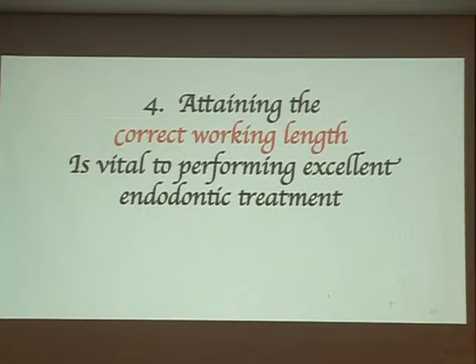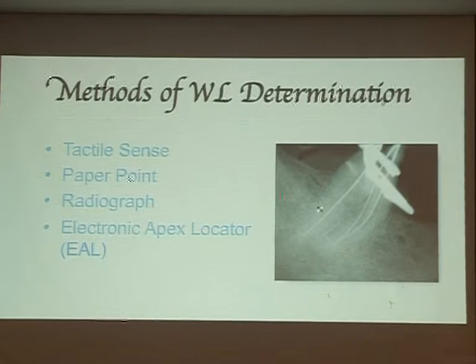Working length. Okay, if you think it is not important, you are wrong. We are doing a root canal. We need to know the working length. How can we do that? Someone give me tactile sense, okay? Paper point, X-ray, and electronic.